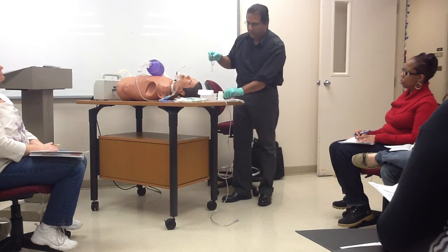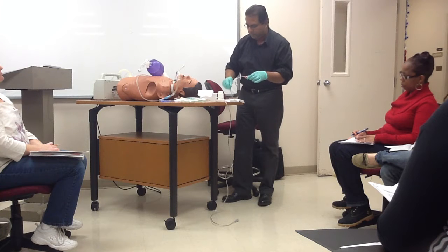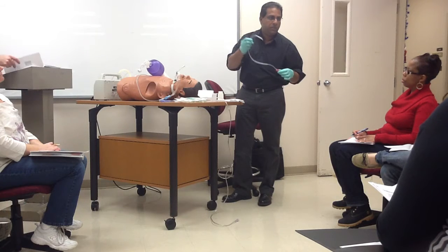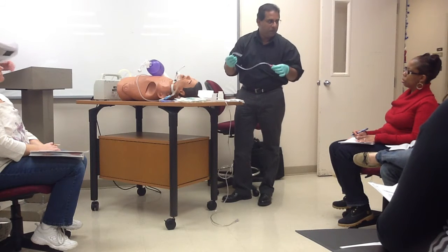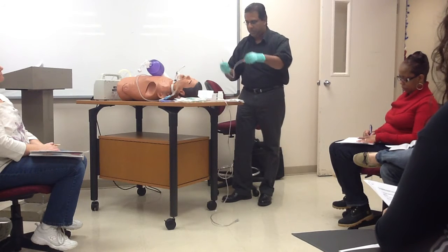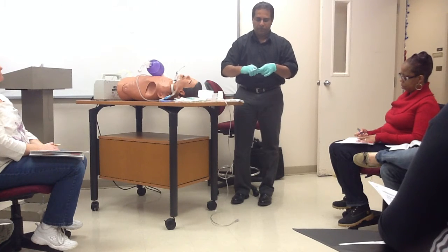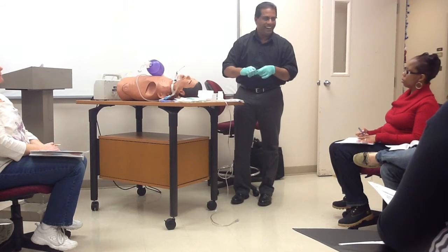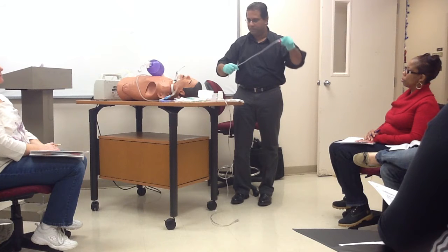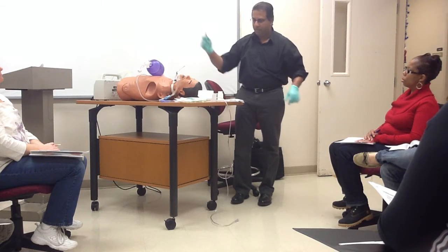Well, I got the lube here already. I'm not going to follow the steps. I'm just going to basically tell you what you should do, okay? Keep it up. What you do next, you want the tip inside. Why is that? If you do this, see what happened? It's already touched. I see that all the time. People do. Yeah, dominant hand.